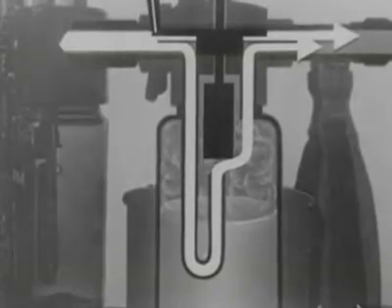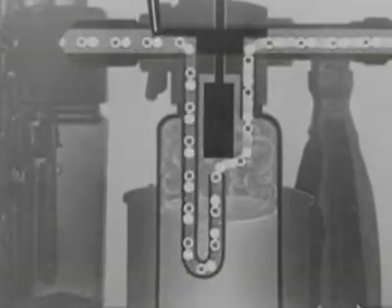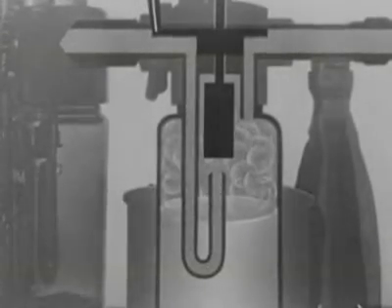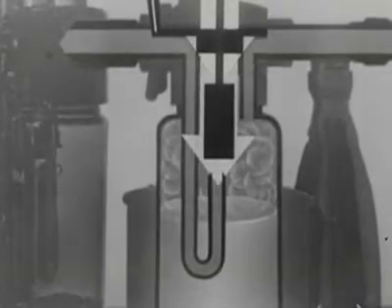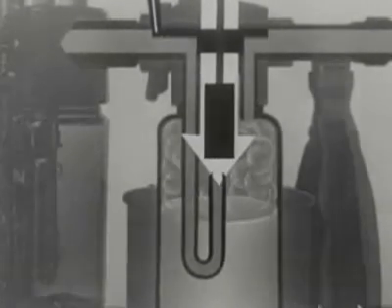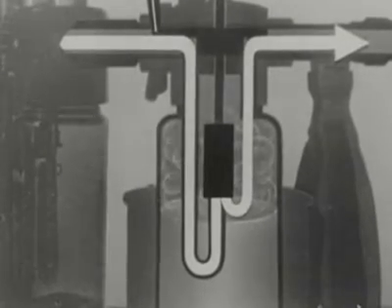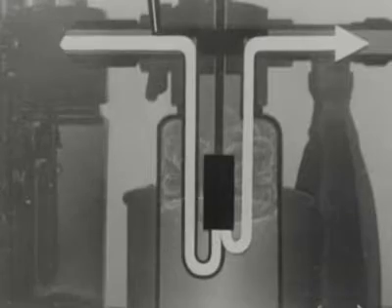Now the tap is full on, and the whole of the gases go through the bottle, carrying ether vapor with them. To increase the concentration of ether vapor still further, a plunger is used. It's attached to a hood which can be made to slide down over the open end of the J-tube. This forces the gases down nearer to the surface of the liquid ether, so that more is vaporized. When the plunger is right down, the gases bubble through the ether, and the concentration of ether vapor is at a maximum.